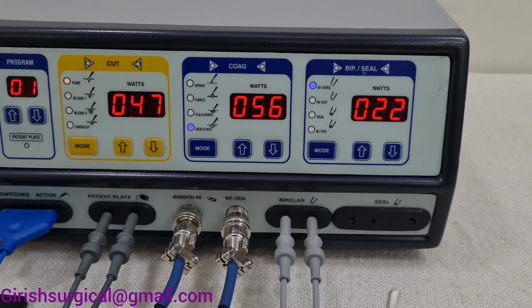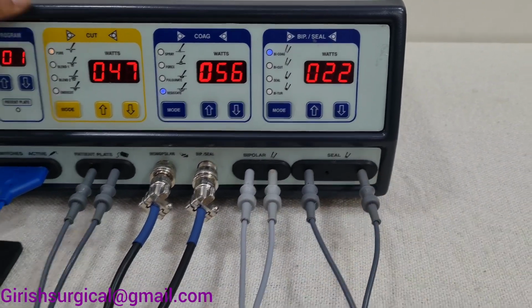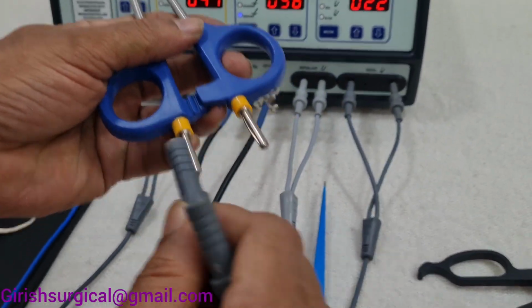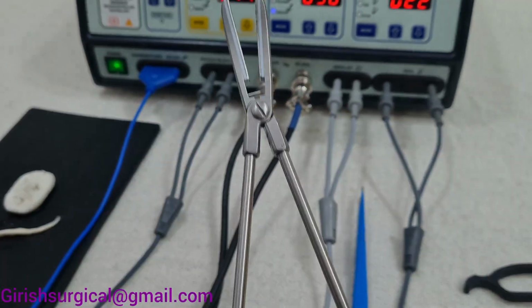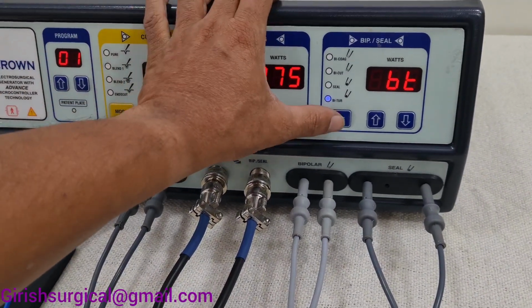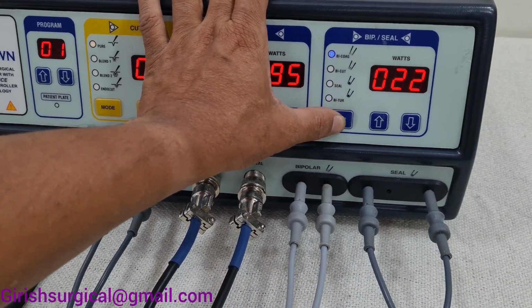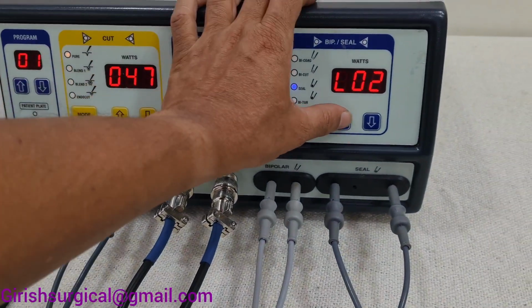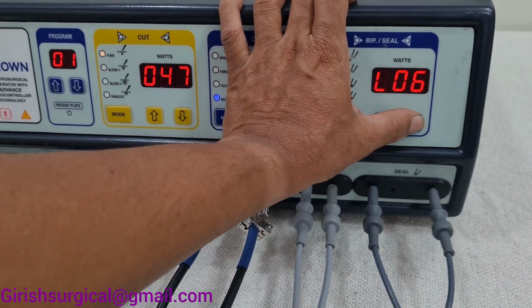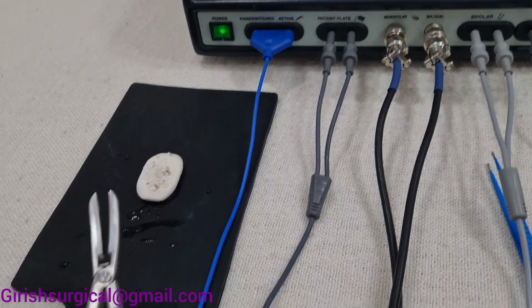Now we'll connect this banana jack pin to the sealing port and the other two to the bi-TUR. When you're using the sealer mode, at that time you have to change the mode from here. You have to come on seal. You have to select the seal mode and put the level 1, 2, it will go till 10. We'll select level 2 and we'll check the bi-TUR. When you're using the bi-TUR, there is no need of patient plate.